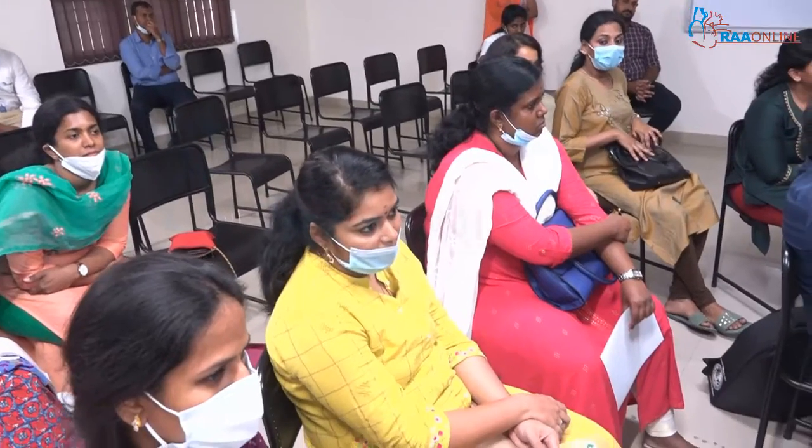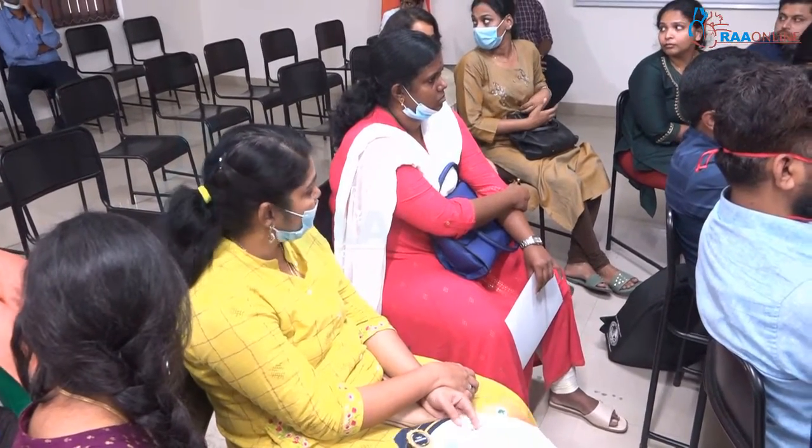Because there was a drop in saturation, obviously you have to go back. If there is no drop in saturation, you would still like to go ahead with another attempt. But between the changes, I would like to ventilate. Yeah, in this situation we will try to mask ventilate. Okay, so that's coming from one person. I agree with that. Maybe I will go back to mask ventilation. Why do you think we have to go back to mask ventilation? Can you say? There has to be a reason.